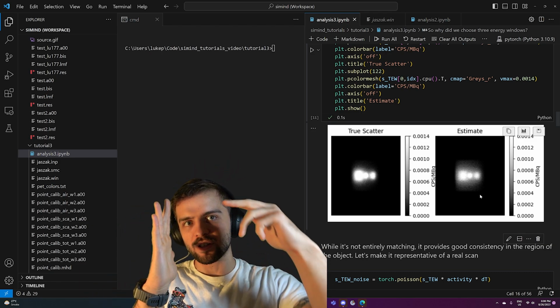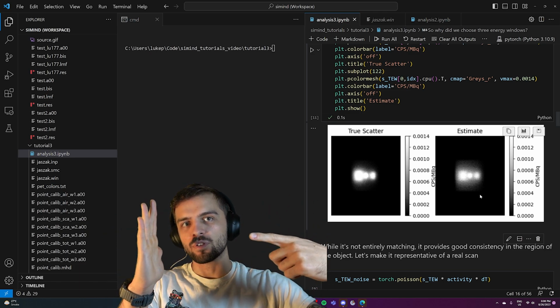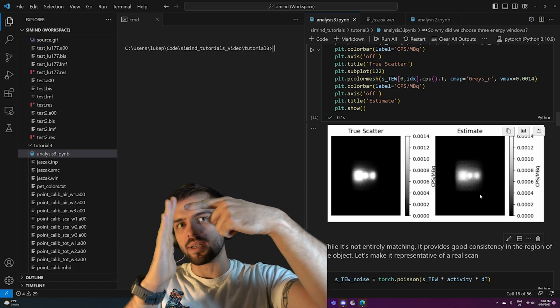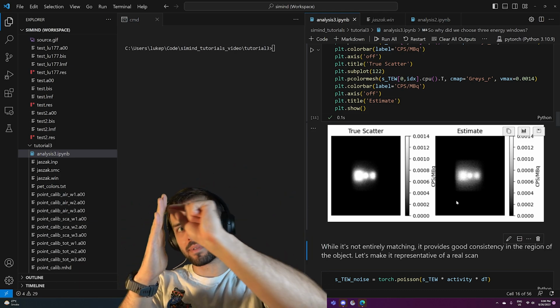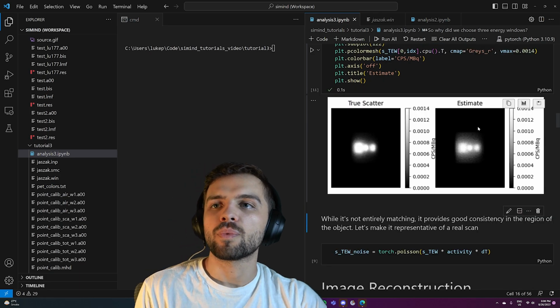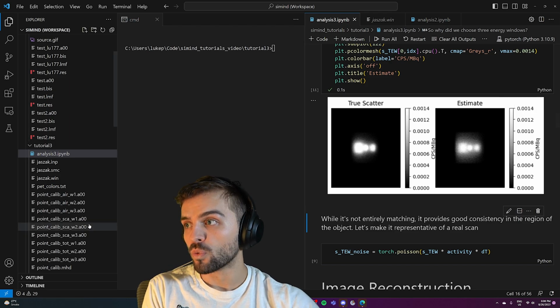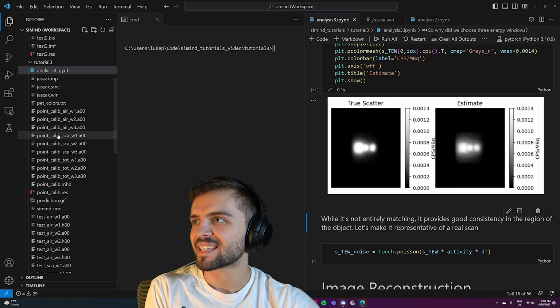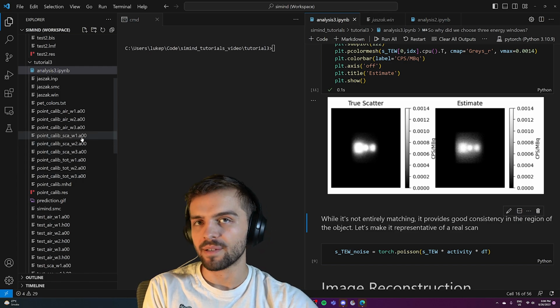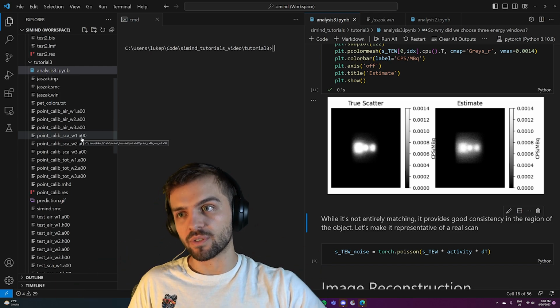Again, remember, scatter events are bad because they give missed counts in the detector. A photon comes, it scatters, and it hits up here. Well, that makes you think that that photon originally came from here, but in reality, it bumped and then hit the detector. So we now have a way to estimate the scatter by using total windows. Remember, we only have access to the total window, so by using 3 total windows, we get an estimate of the scatter window at the peak, right? So we're using total windows to estimate scatter because in real life, we only have access to total.